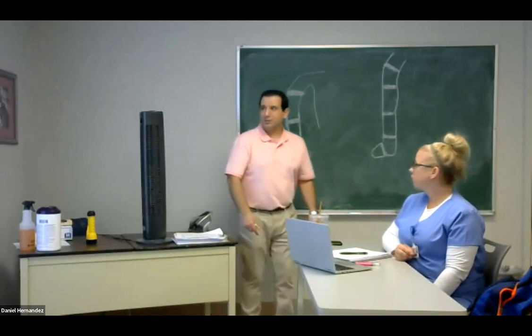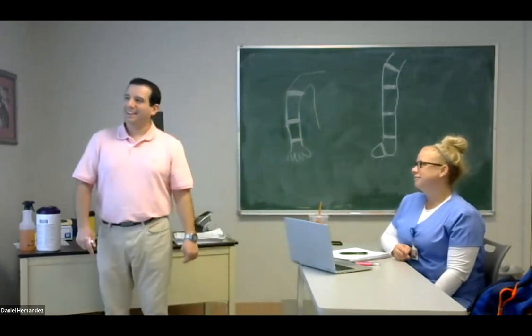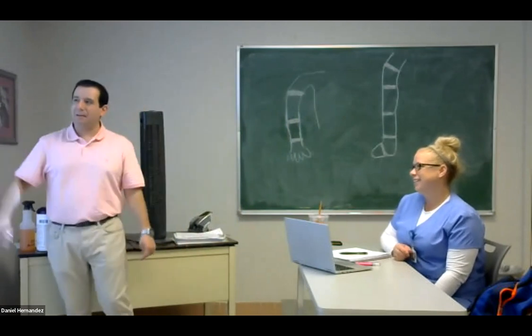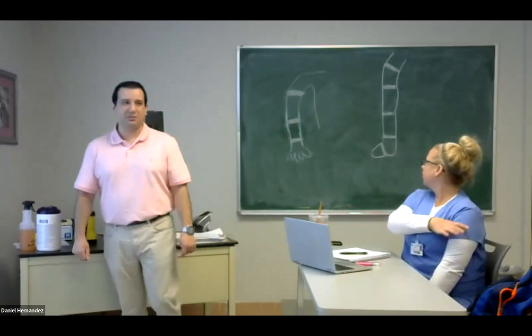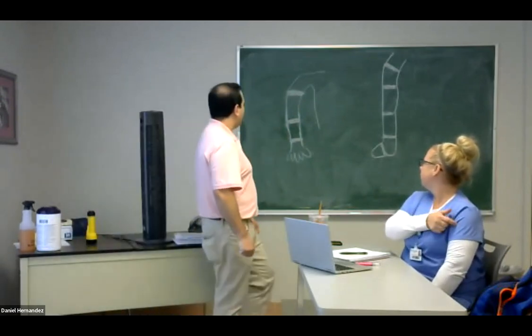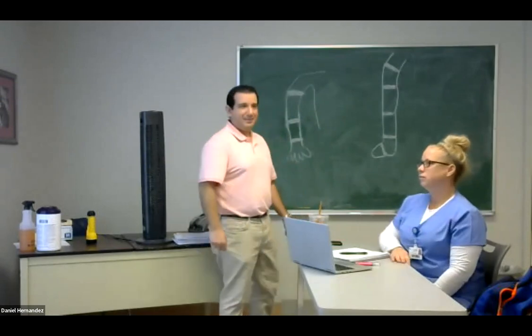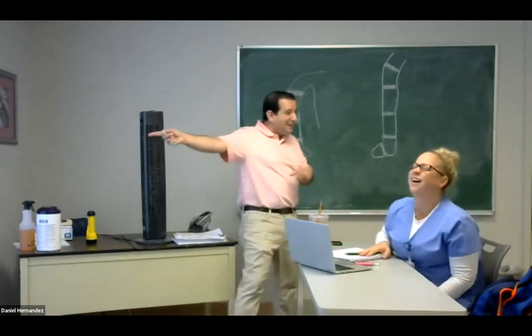If it's abnormal at all the cuff sites for the arms, we have to figure out which vessels could potentially be involved. Then it's got to be above, so would it be like subclavian or axillary? Axillary, very good.